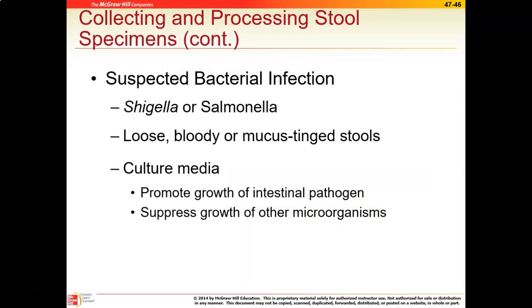Then we might have a reason to check the stool for a bacterial infection. Most viral gastroenteritis or stomach flus are virally related, rotavirus or a few of the other ones that cause it. There are certain cases where people can have food poisoning or some sort of bacterial infection. If an individual presents with fever, and not just loose stools, but bloody and or mucus tinged stools mixed with a fever, there's a little bit more of a risk for bacterial infection. And so we can utilize certain growth culture mediums that can actually isolate either Shigella or Salmonella. Those are the two most common bacterial infections that can affect the bowels. Okay. And so if someone presents with suggestive bacterial infection, they might have to go home with a stool culture to check for these particular bacteria.